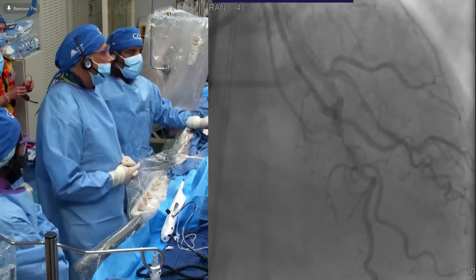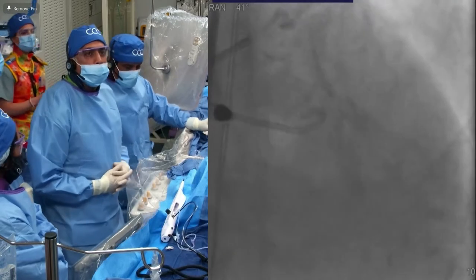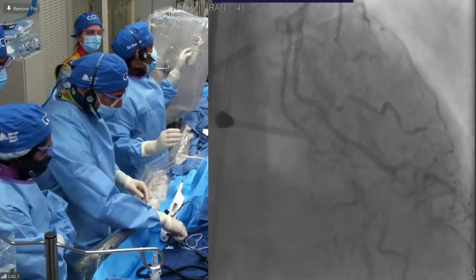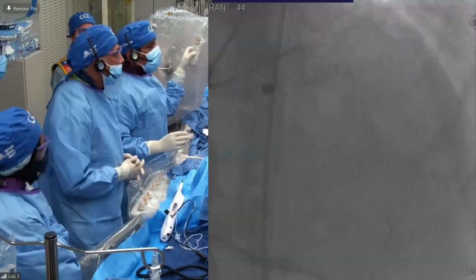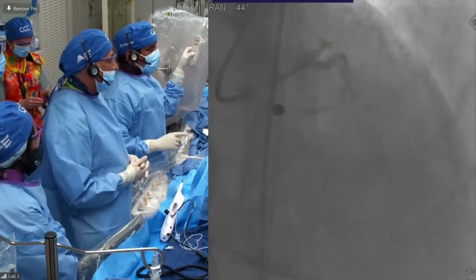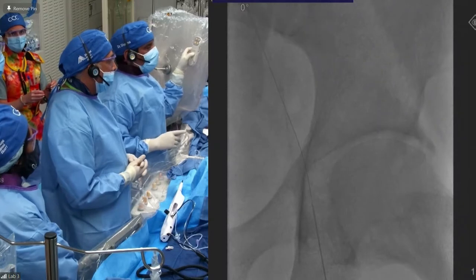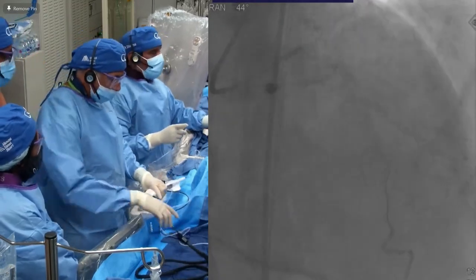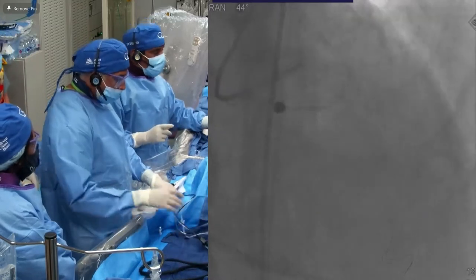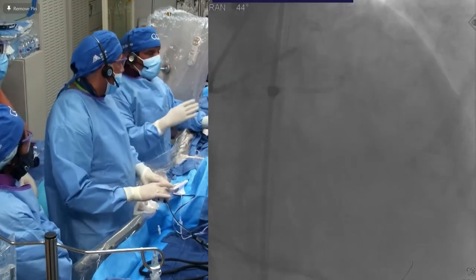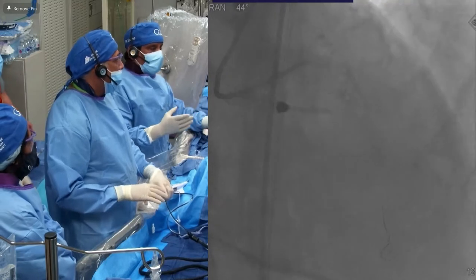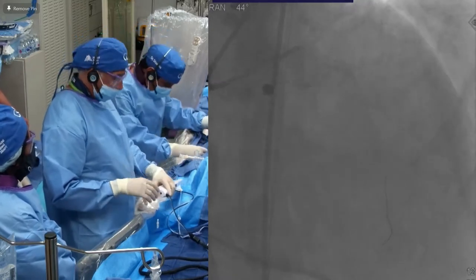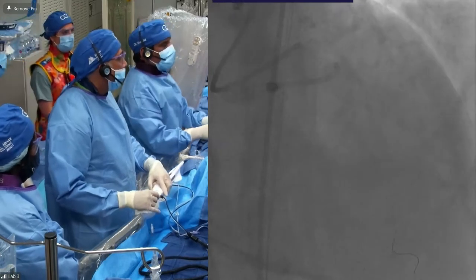So this is where we are now. We have wired the LAD - a little tortuous, but we are able to do it. This is the floppy wire and we are ready with a small 1.5 burr. We thought whether to use 1.25 or 1.5, but clearly we wanted 1.5, and we are able to get our fine cross without trouble. If there would have been difficulty, I would have gone with a 1.25.